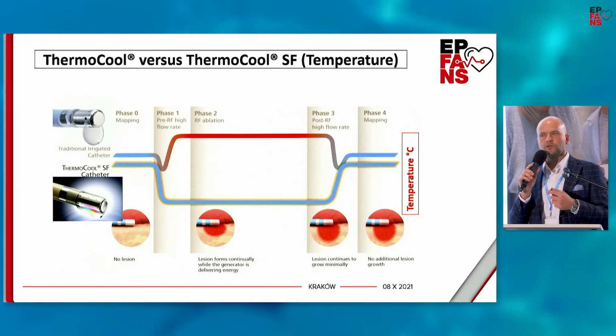That is why, while using power control mode and cool tip catheters, the operator should observe all other signs and symptoms of tissue overheating. In summary, every physician performing ablation must know the biophysics of ablation. Before attempting a procedure, every electrophysiologist needs to know how the generator works, how the catheter is constructed, how to properly set power and temperature, and finally, how to interpret displayed parameters.